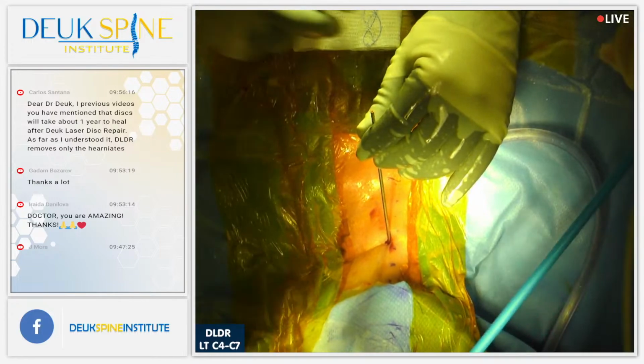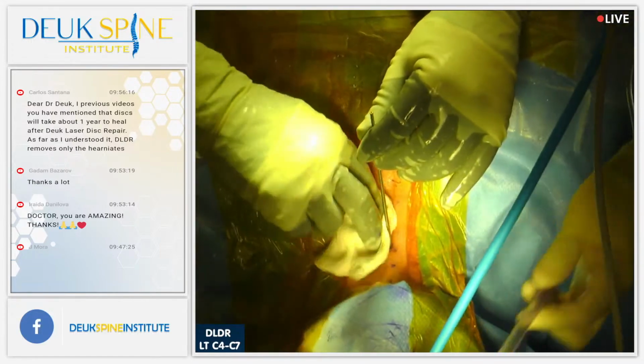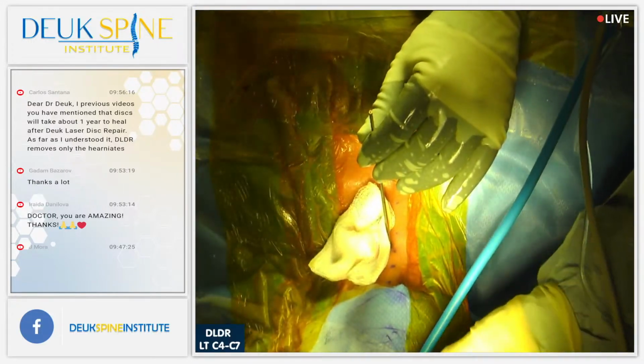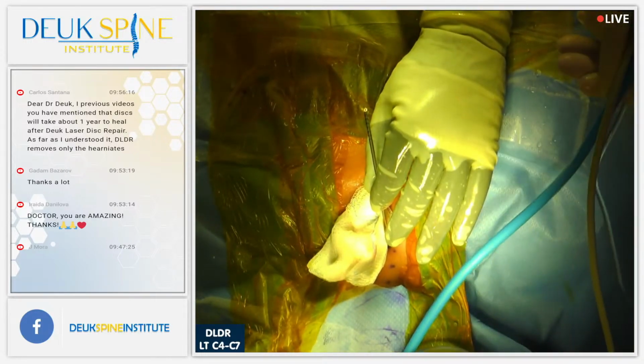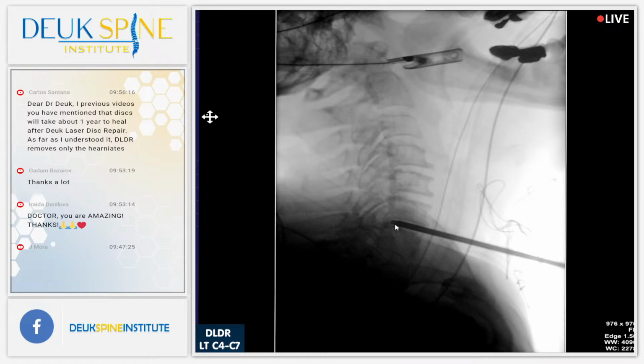And then now I've just got the dilator, right? Still no bleeding. There's the x-ray. You can see the dilator. Show us the dilator tip. The dilator tip is right there. Now we're going to come out of this 6, 7. We're going to move up 2 discs to 4, 5. You ready? Keep your eyes on the rabbit. Coming up. Shot. I'm just about out.